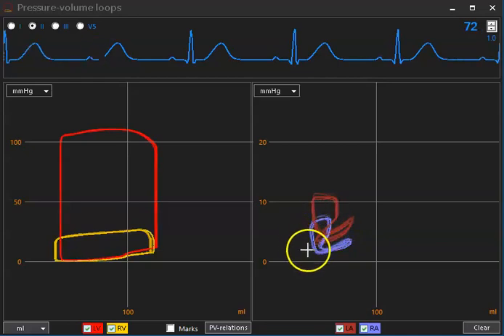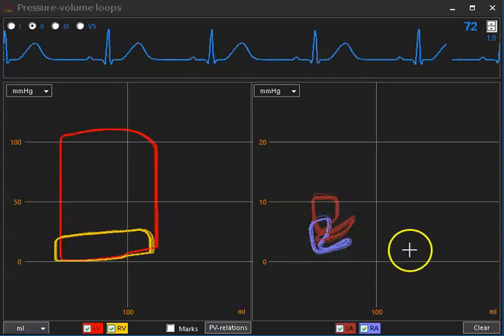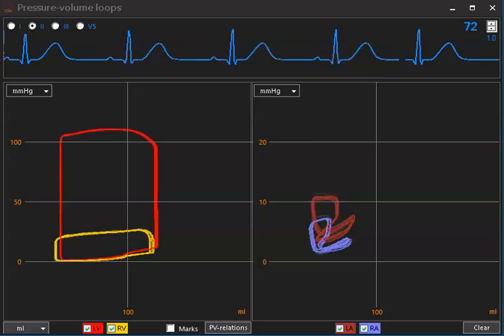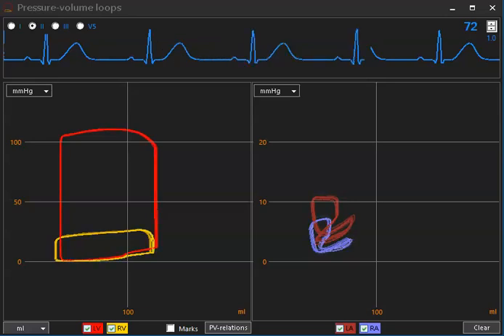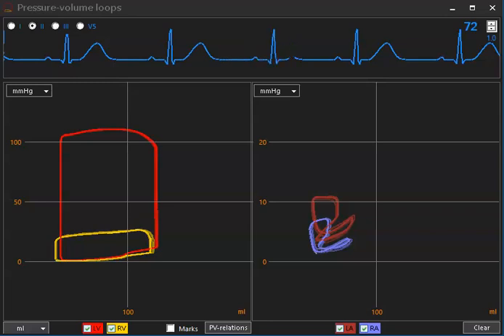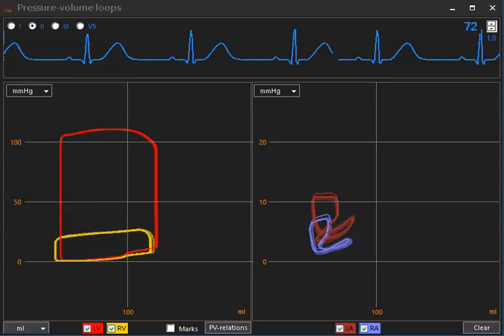In blue, pressure volume loops from the right atrium. After creating heart failure, I will show the interactions between left and right heart function, first without veno-arterial ECMO and then with veno-arterial ECMO.